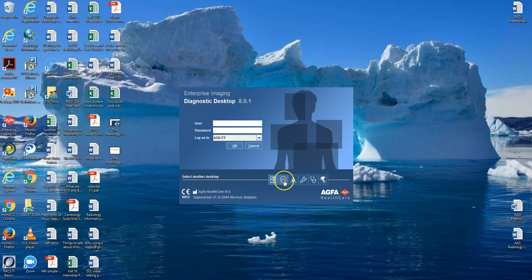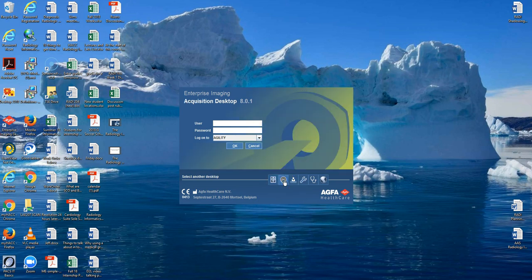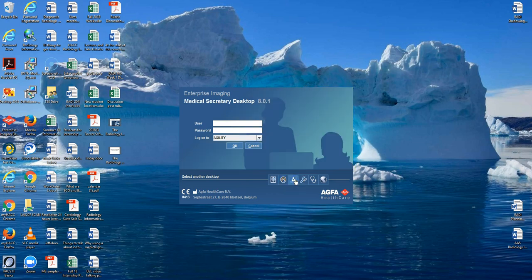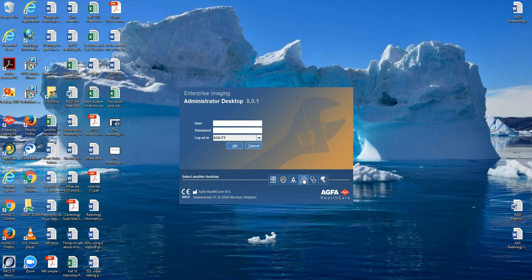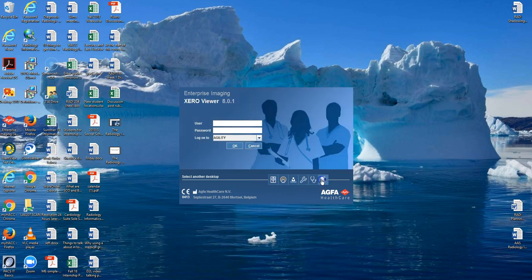The first desktop is a diagnostic desktop meant for radiologists who read the images. Acquisition is meant for the technologist and is the best one for just looking at images. The medical secretary desktop is for people who work at the front desk or file room to input information. The administrator desktop is for PACS admins who want to make changes to the configuration of the system.